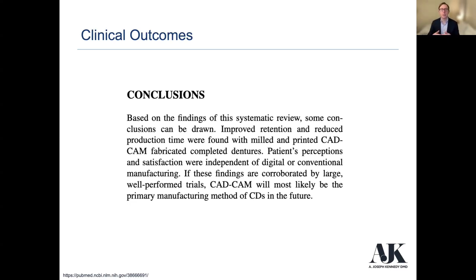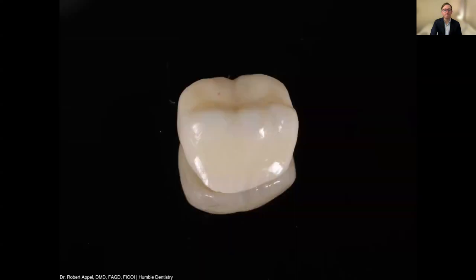So not statistically different, usually after about 90 days. But again, here you can see we know that improved retention and reduced production time are going to be found with these milled and printed units. Perceptions are really independent of digital or conventional manufacturing, and we just want to see more studies of this kind in the future to really make sure that we know we're going in the right direction.